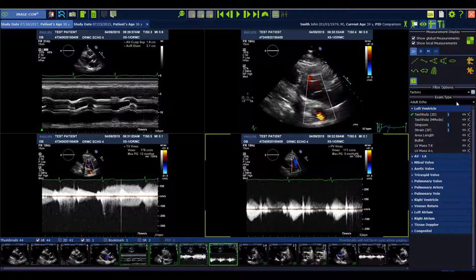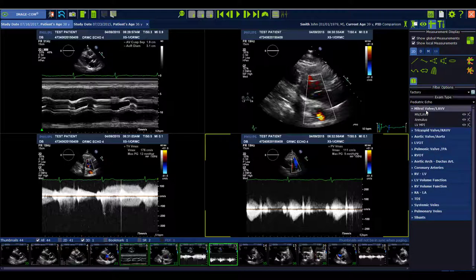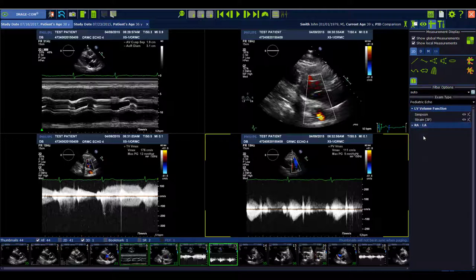For the exam types, we now have adult echo and pediatric echo, where you can select different measurement packages. Here you see the pediatric echo, and of course you can also set different measurement menus for specific measurement categories.